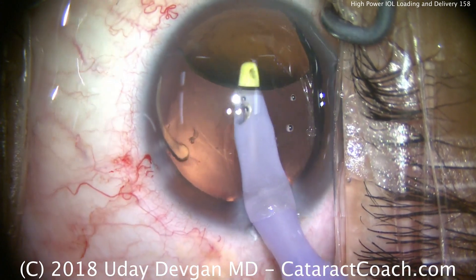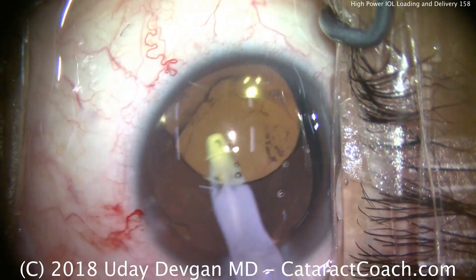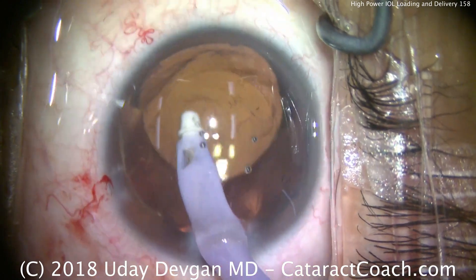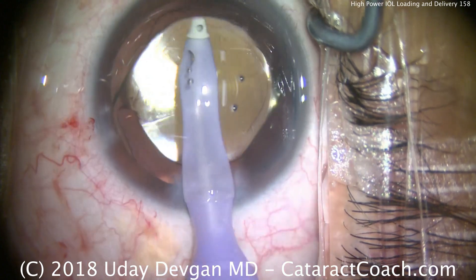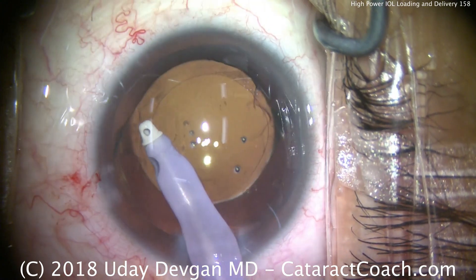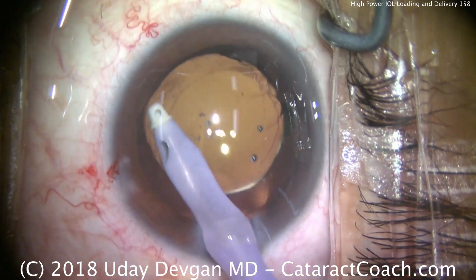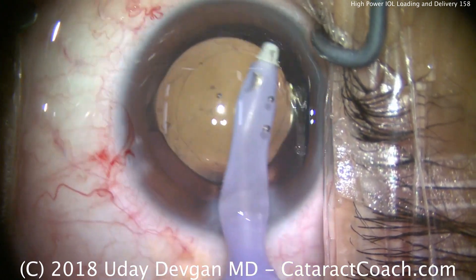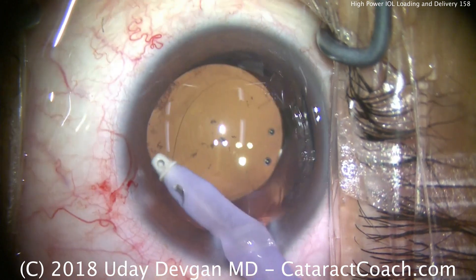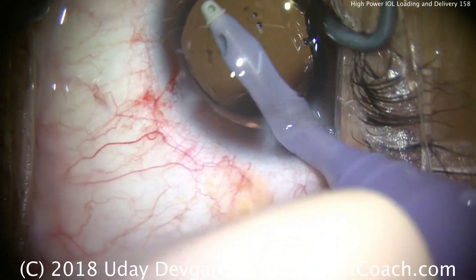Do your calculations carefully. Remember that lens calculations in highly hyperopic eyes are a little less accurate. The big challenge is when the lens power exceeds 30 diopters. In the U.S. we do have special order IOLs available up to 40 diopters for a single-piece acrylic lens; beyond that they are not readily available in the U.S., though they may be in other countries. In those situations, I recommend implanting the maximum available power lens, and if needed you can do a piggyback lens later.